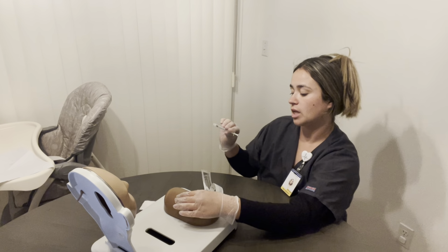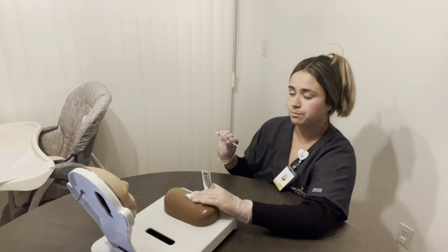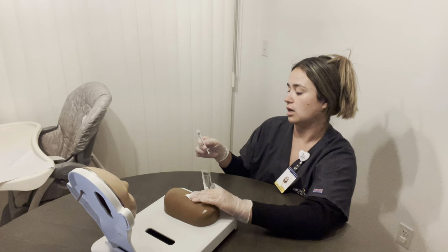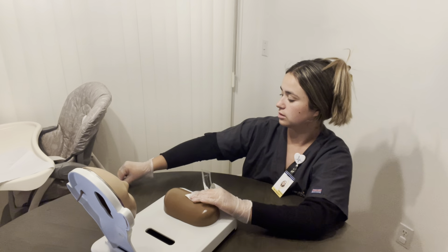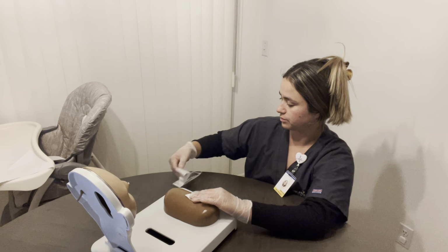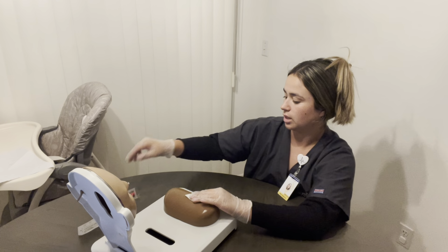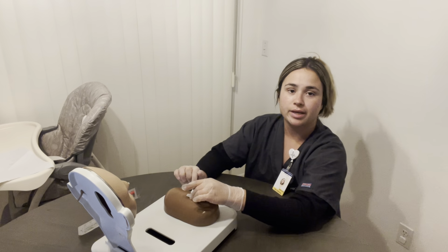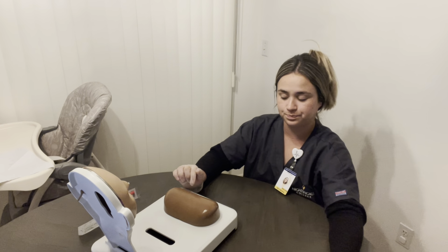Just like that. And making sure to put the gauze, okay? Now I will discard this into the sharps container and the biohazard. That's trash too. Okay. Sometimes we can put a Band-Aid on if needed, if there's any blood, but it looks good now.